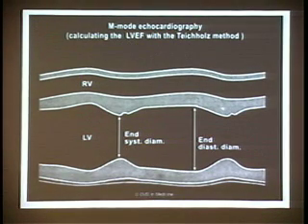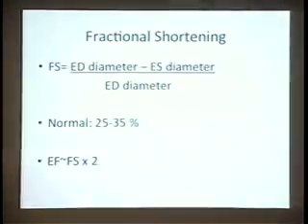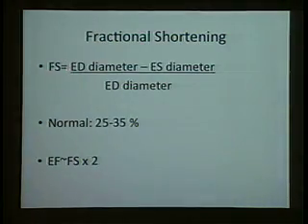And when you apply your M mode, it allows you to really very easily see that. This is the ventricular cavity in diastole. This is the ventricular cavity in systole. And you generate a ratio of the diastolic minus systolic over the diastolic, which is going to be your fractional shortening. Okay? And the fractional shortening is a number that is not an EF. Okay? It is fractional shortening.